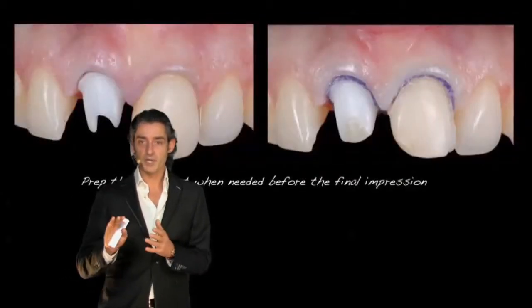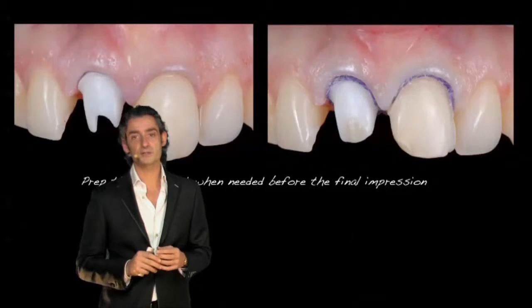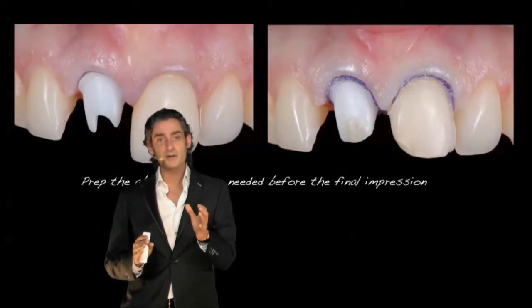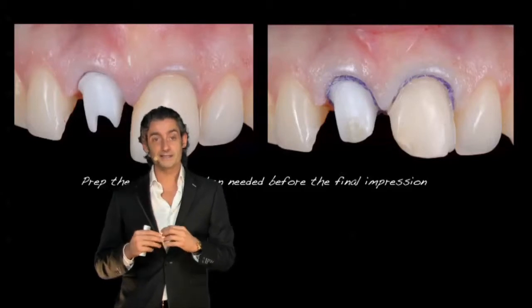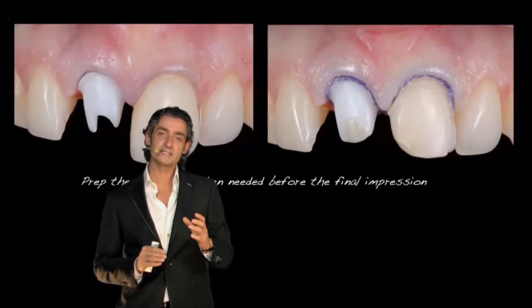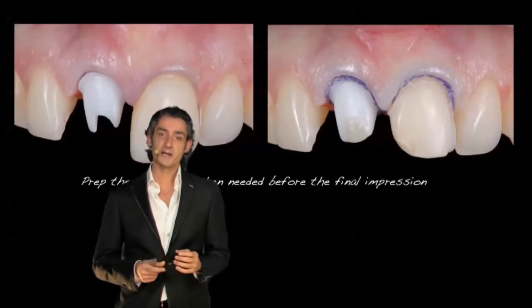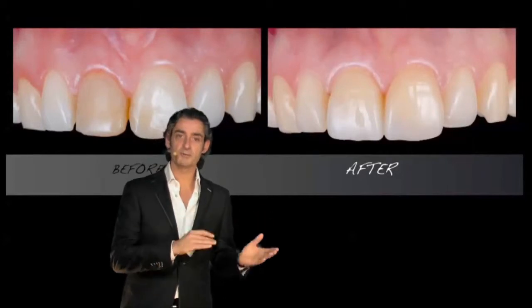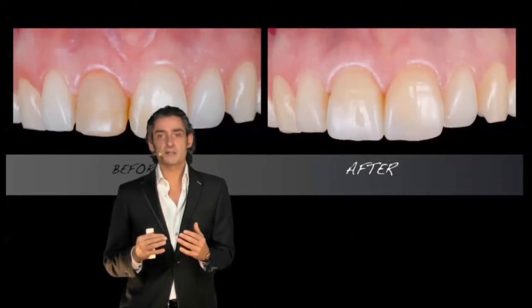And look at here, the preparation of the veneers also in the other central incisor, and in the distal area, just to improve the zenith, there was the need for a slight preparation of the distal part of this final abutment. And this was my impression. And look in here, before and after. For me, this is a nice result.